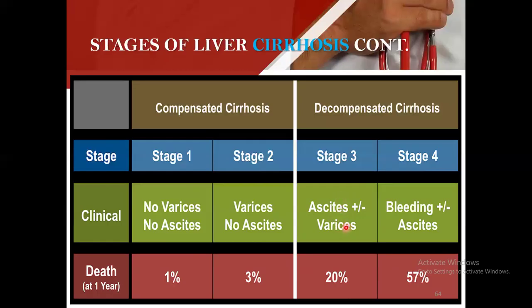Varices is a constant thing in stage 3. In stage 4, varices is still there. Even though they say it may or may not be there, it will be there.